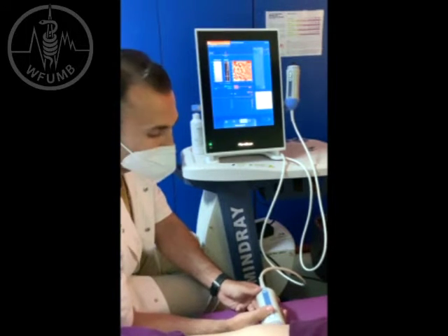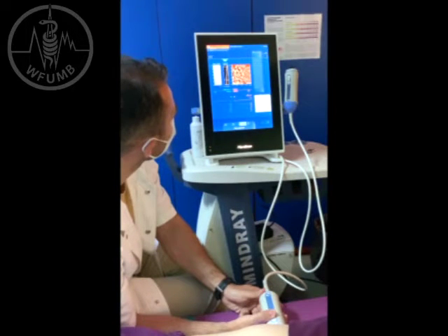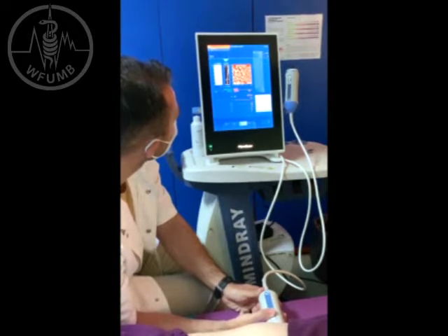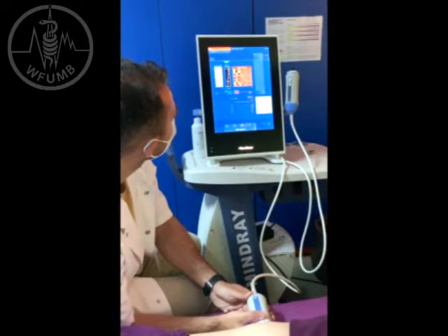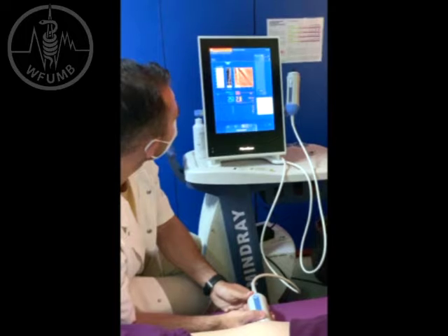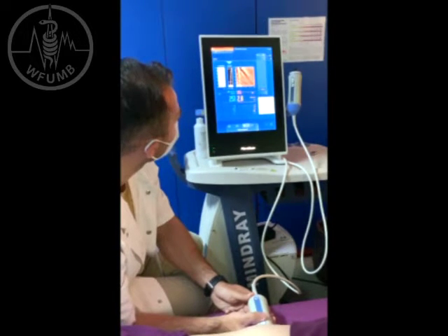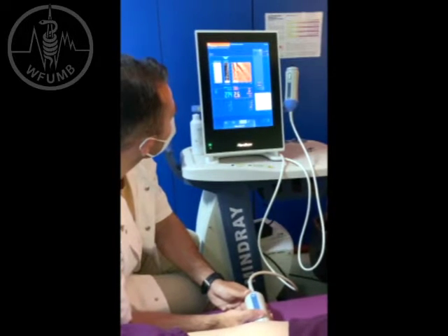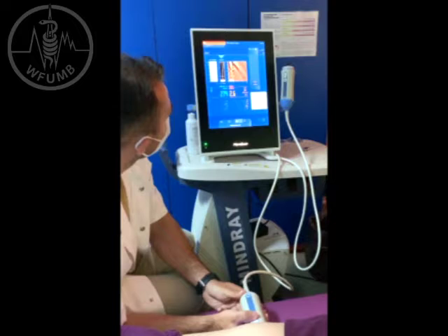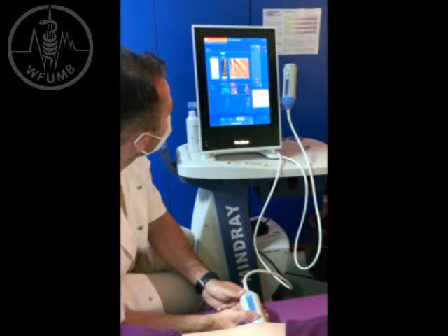Okay, now we have an invalid measurement. We switch a bit the position. Another invalid measurement. Okay, now we have a good measurement. We wait a bit for a homogeneous line. We perform 10 measurements. After performing 10 measurements, we have the values reported.